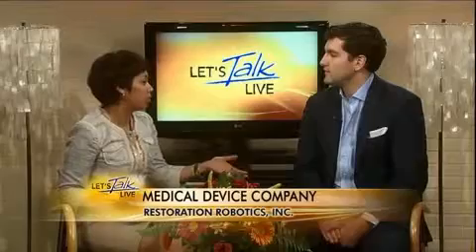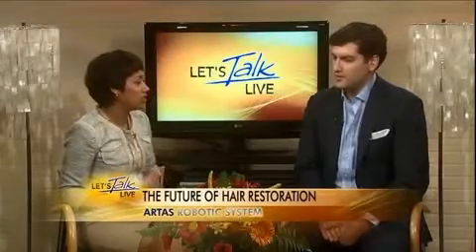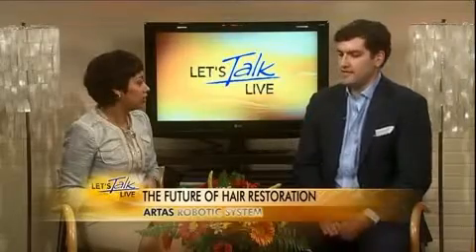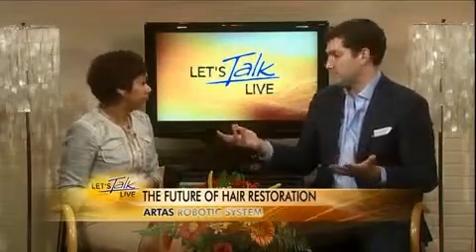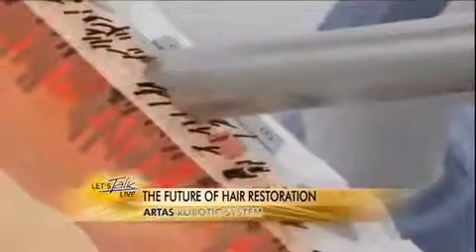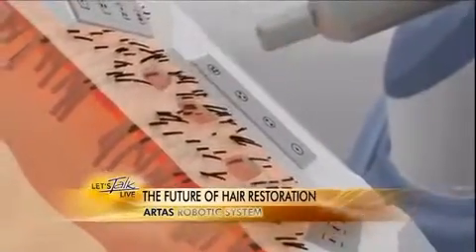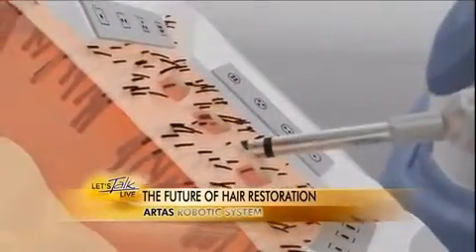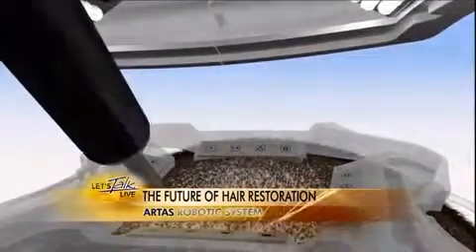Tell us exactly what the procedure is. Is this like hair plugs as we used to know it, or is this completely different? The technology of surgical hair restoration has really evolved. We used to take plugs, where we would cut out a circular stretch of skin and put it in the thinning area. That also sounds painful. Exactly, and you would get that kind of doll's hair look where you get a clump of hair coming out. But unfortunately, those patients who had that procedure 20, 30 years ago are still walking around.